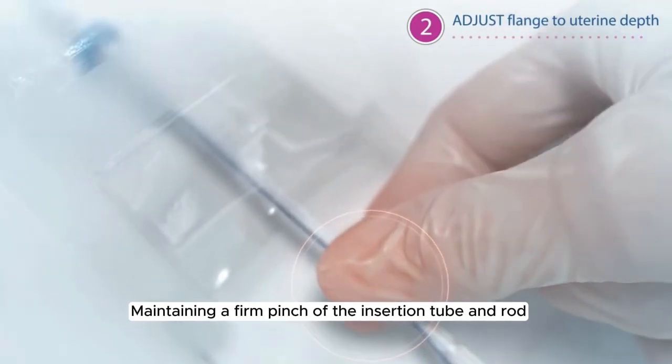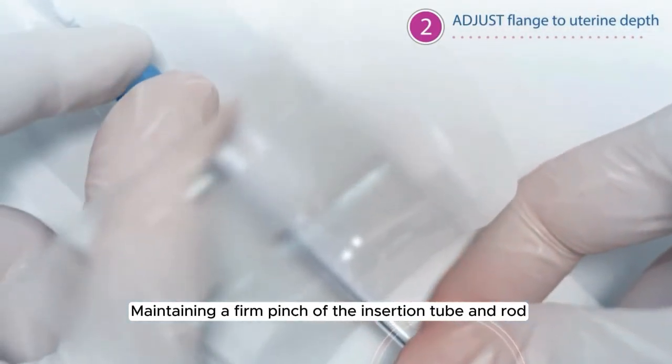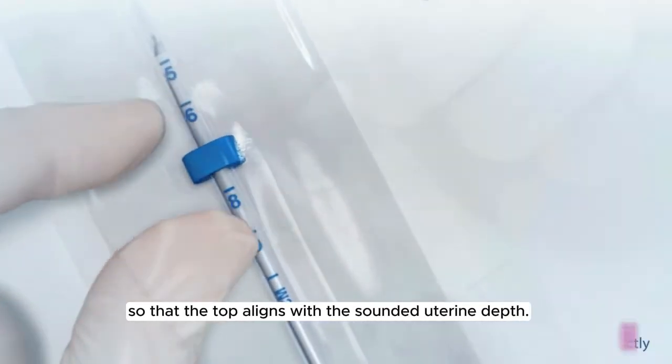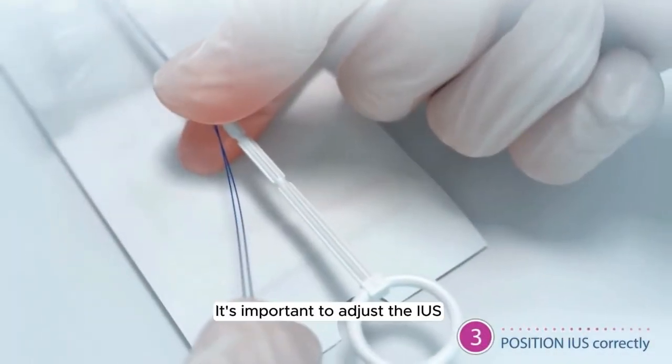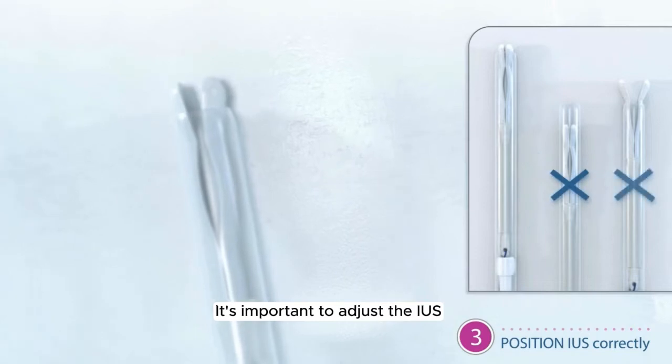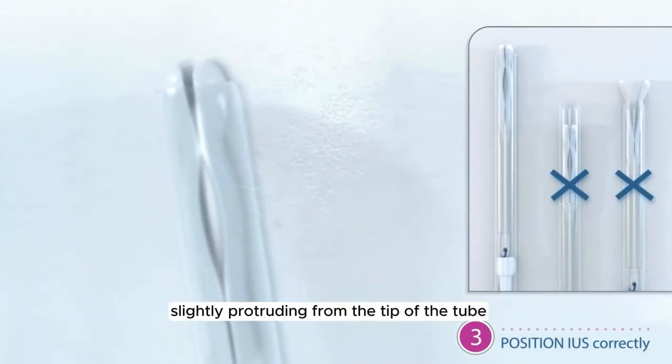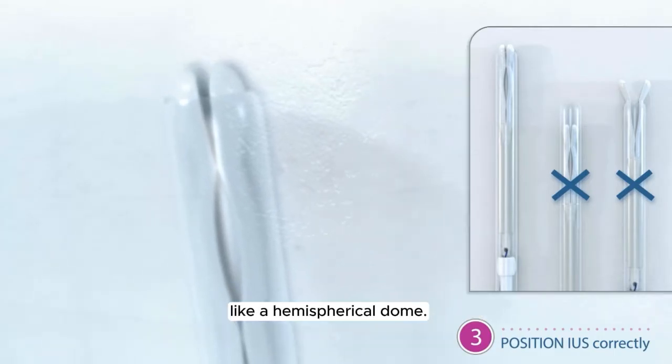Maintaining a firm pinch of the insertion tube and rod with one hand, move the flange so that the top aligns with the sounded uterine depth. It's important to adjust the IUS to ensure the knobs achieve a rounded end, slightly protruding from the tip of the tube like a hemispherical dome.